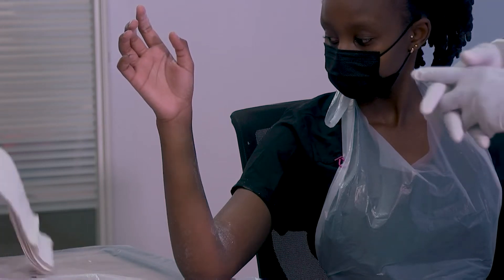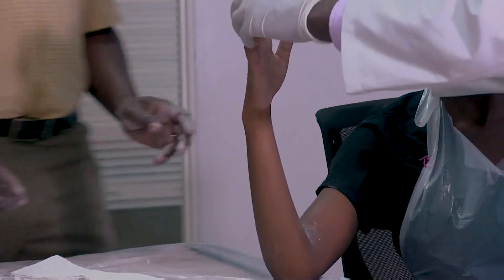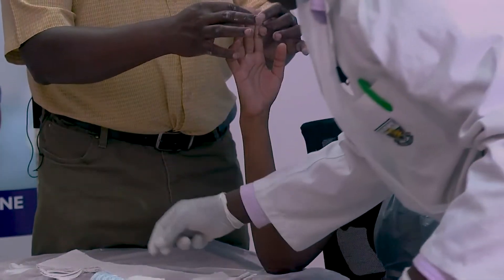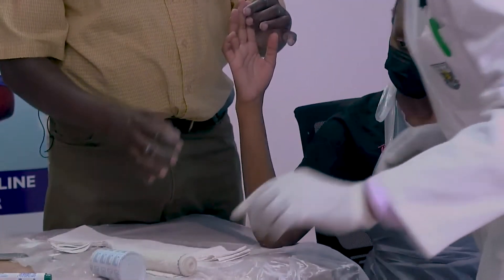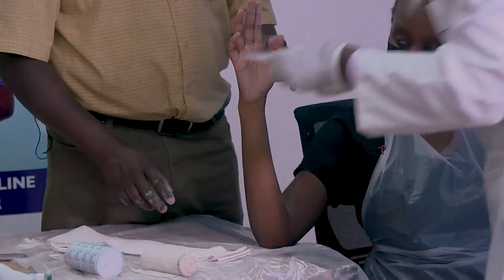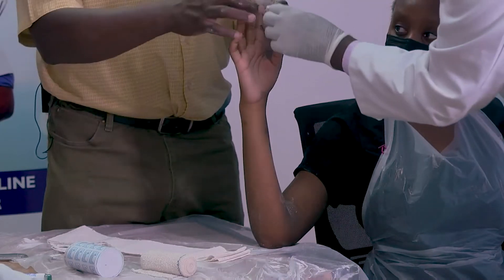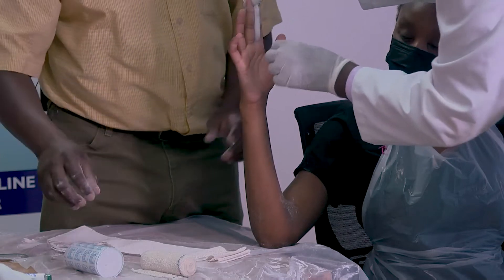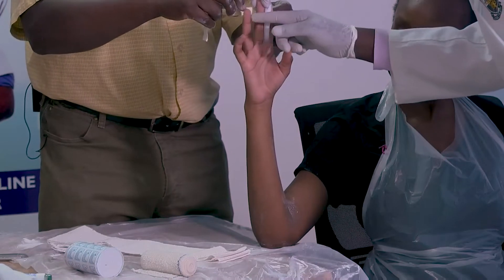We position the patient's hand and then we need a small soft band in between the two fingers. In between the two fingers — ensure it's straight. Then we get our taping. I will take that for you there, for the distal part. Your fingers are level.